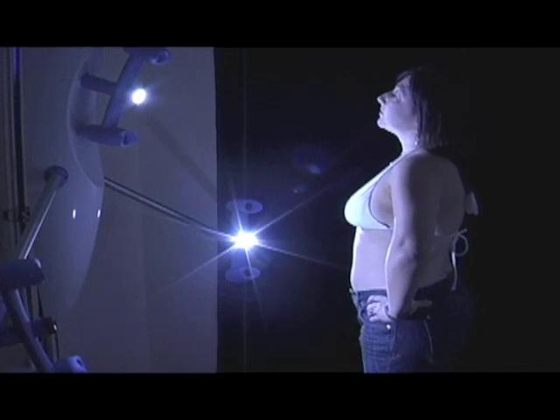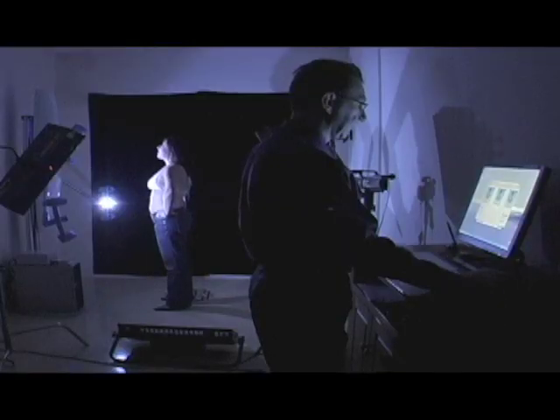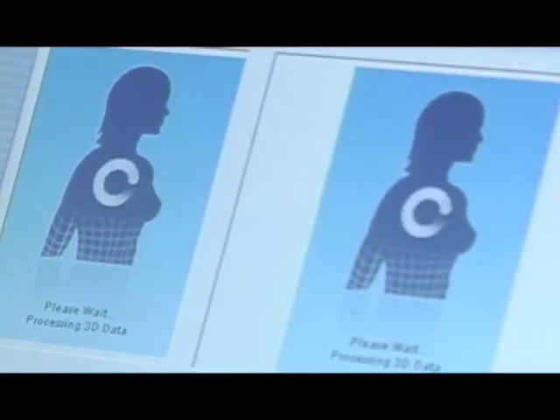Actually taking the three-dimensional picture is easy — just stand in front of the camera. We then line you up with each of the high resolution digital cameras that are in the three heads. Then I push the acquire button, and in about two seconds the computer is able to get all of the pictures that it needs to construct the three-dimensional model.